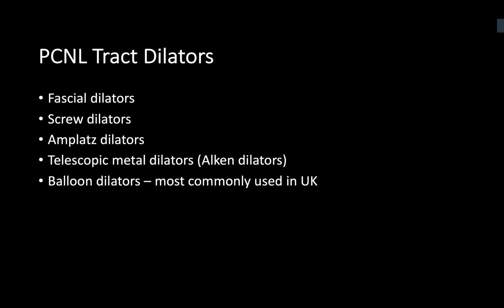Exactly. Hello, can you hear me now? Yes, please go ahead. Thank you. Sorry, I don't know what happened. So going back to the question about the dilators. There are metallic dilators, which involve serial dilatation going up in sequence, with a larger dilator put over a smaller one, and serial insertion and removal. And there is also dilatation of the tract using a balloon up to a certain pressure, and over that a plastic sheath is then inserted.